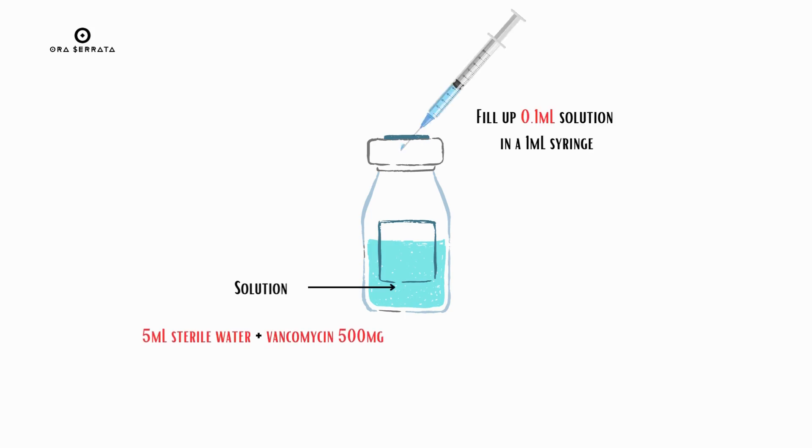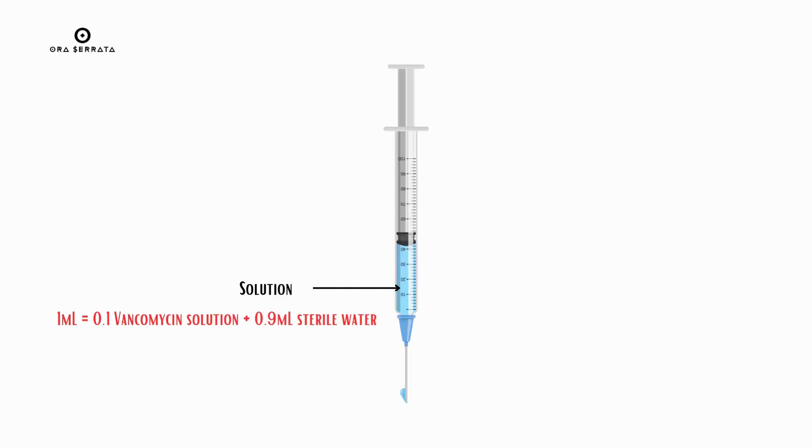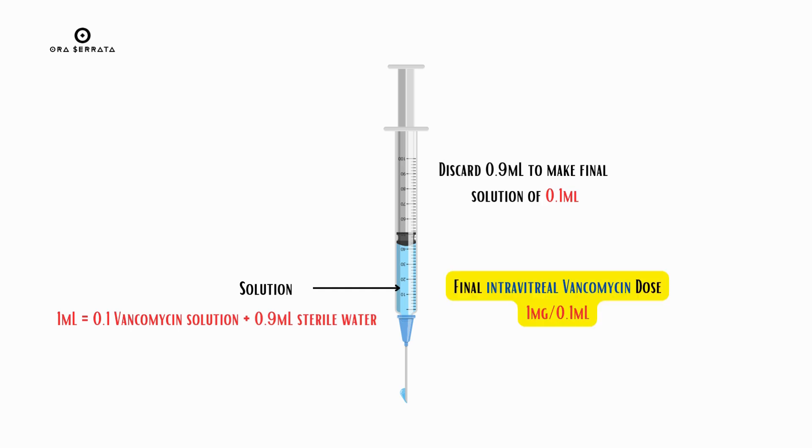Take the solution and use a 1 ml syringe to fill up 0.1 ml of the solution. Fill the remaining 0.9 ml with sterile water to make the solution 1 ml. Now discard 0.9 ml of this solution to get a final solution of 0.1 ml — that is your intravitreal vancomycin.